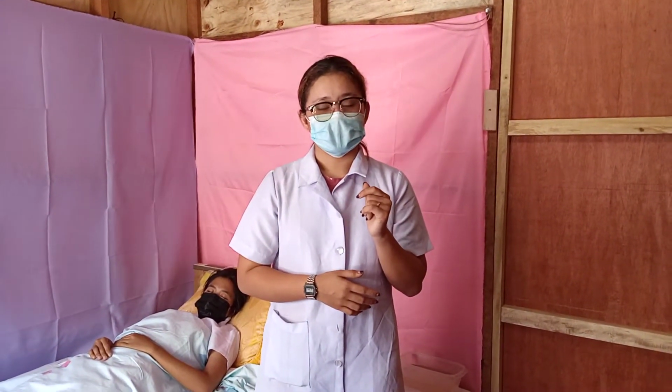Rationale: this position places the brachial artery on the inner aspect of the elbow so that the stethoscope disc can rest on it conveniently.